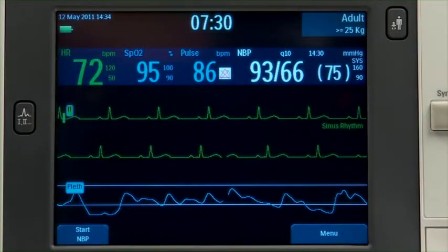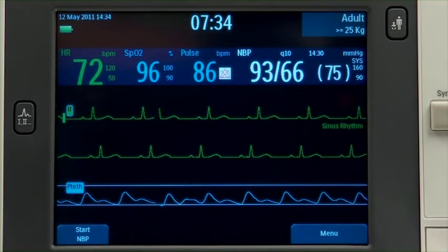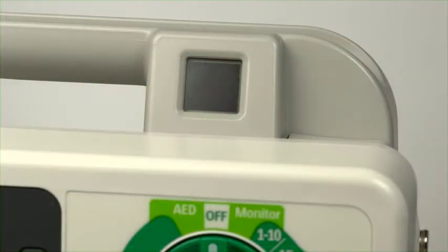To assess operational performance and alert you if a problem exists, the XL Plus routinely performs automatic self-tests. The results of the tests are reported through the ready-for-use indicator and messages when you turn the device on. The blinking black hourglass symbol indicates the shock, pacing, and ECG functions of the device are ready for use and sufficient battery power is available for device operation.